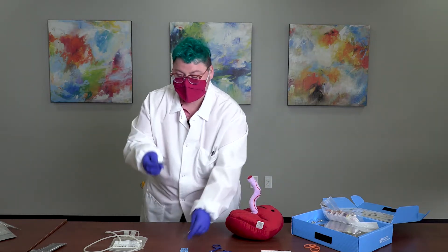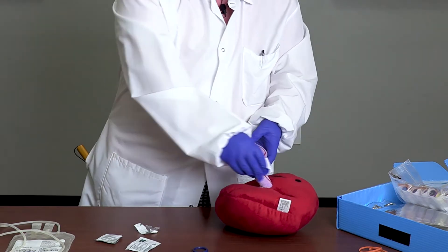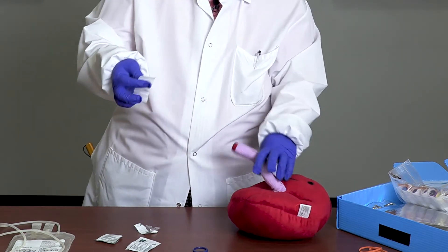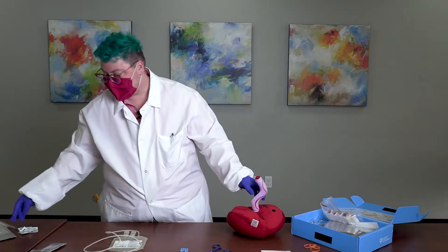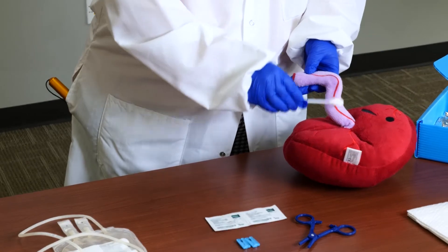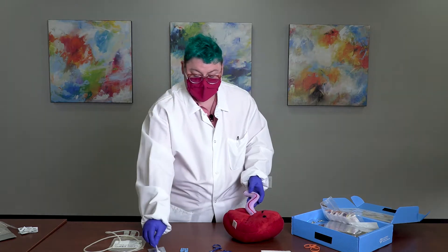The first step to collecting cord blood is cleaning. First, use the chlorhexidine swab to wipe any biological residue from the umbilical cord, pulling away as much residue as possible. Next, use the chloroprep swab stick to clean the venipuncture site for 30 seconds, then let it dry for 30 seconds. Due to the prevalence of delayed cord clamping, we recommend this cleaning process occurs prior to clamping the umbilical cord, since the cleaning and drying takes about 60 seconds total.